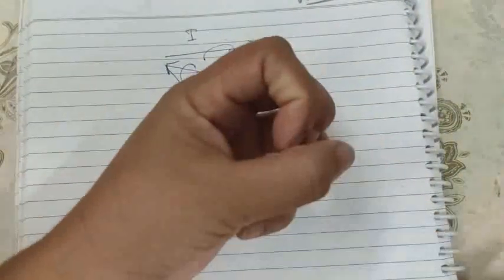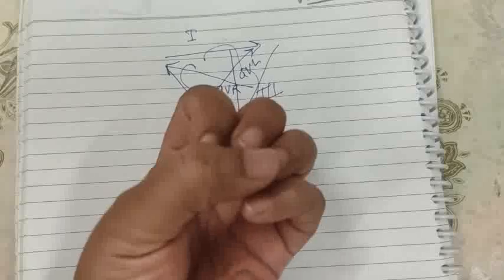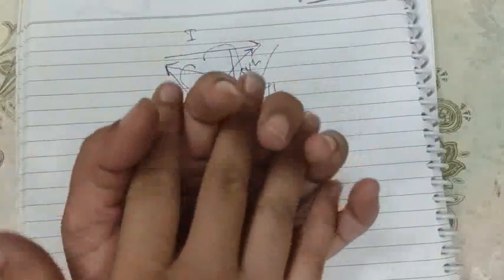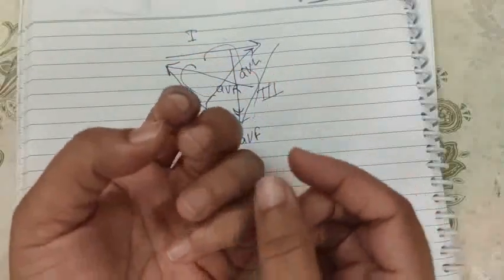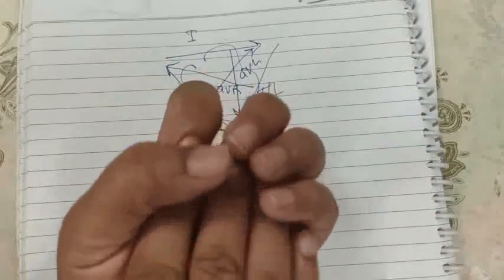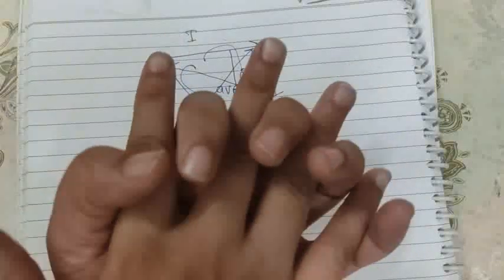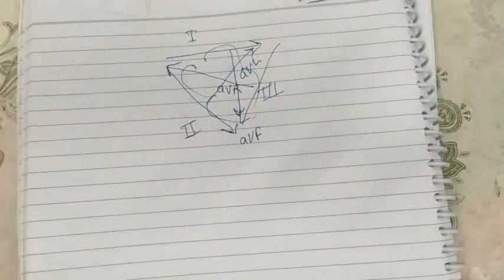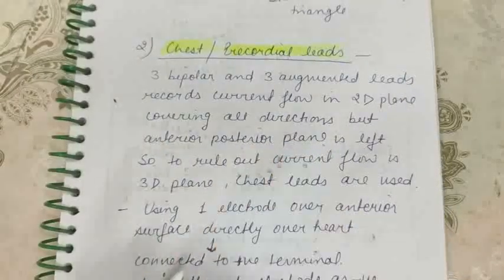But assume this is heart, right? For example, this is heart. So this and lateral activity is not captured, right? Two-dimensional we have done. But what if there is some issue or MI in anterior, posterior, or lateral side? So if this is heart, which is a 3D activity, we have to measure the anterior, posterior and lateral planes as our chest leads. Okay, that's why we need 6 precordial leads.